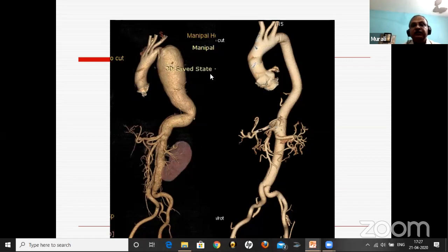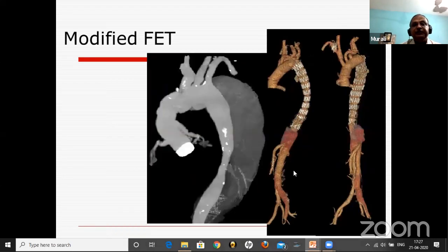And you can see here the surgical result. This is a follow-up angio after 1 year. The whole aorta was replaced with a graft. The spinal intercostal arteries were attached as much as possible. The celiac, the superior mesenteric, all renals were reattached. I think this guy did not have one renal, if I remember right. So he did well with this procedure.